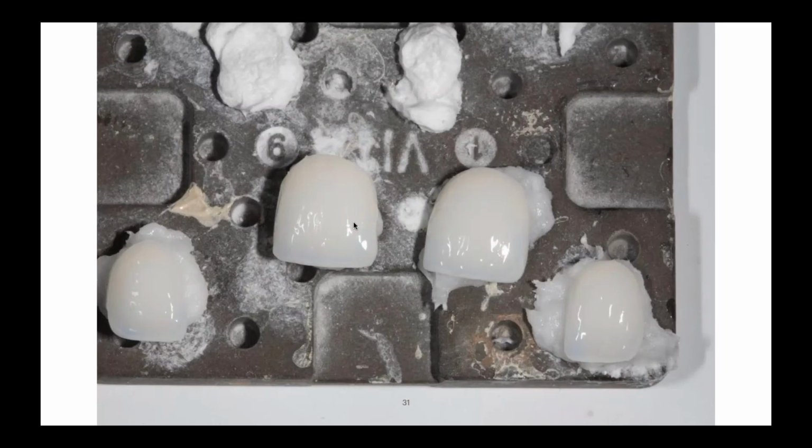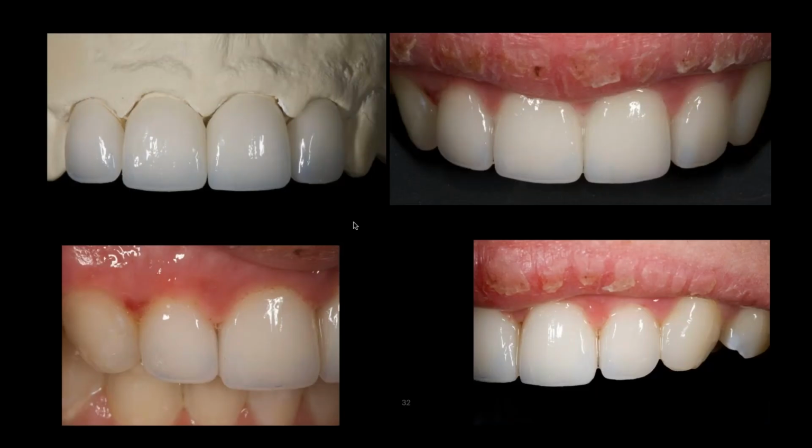So here's a typical veneer case that I did with VITA blocks. And these are veneered. I just put a little putty and I jammed them on a tray there. That's it. And then that fires on there. And you can see the model, the bluish and the halo. This is actually VM9 with the, I can't remember the name of the blue now. There's too many names.